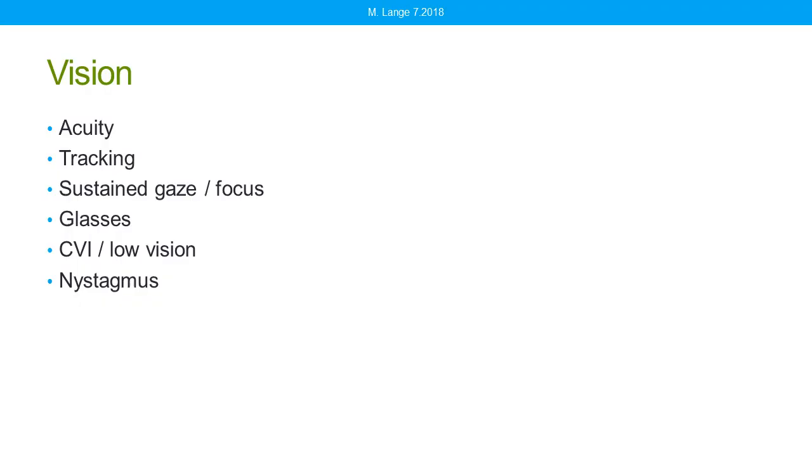Okay. Before we get to vision, let's see. Someone has asked, any suggestions for drooping eyelids, preventing proper pupil capture? There are some clients who have difficulty keeping their eyes open, and this can be for a variety of reasons. I've worked with a few clients who have spinal muscular atrophy, who have difficulty because of profound muscle weakness keeping their eyes open. In those cases, we've sometimes had to look at a different access method because we simply can't capture enough of the pupil.